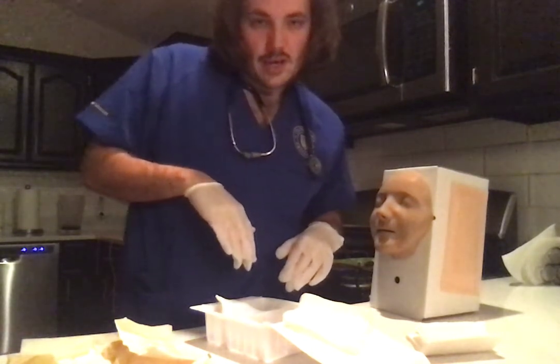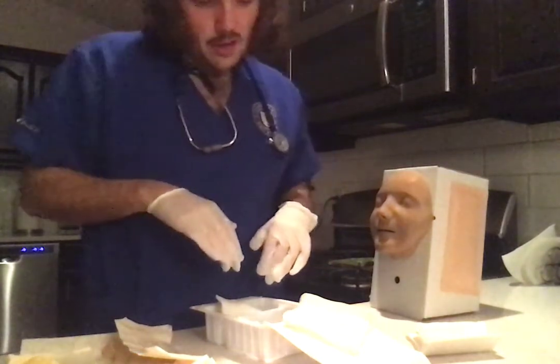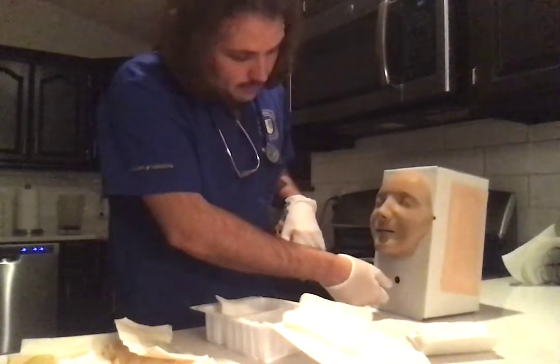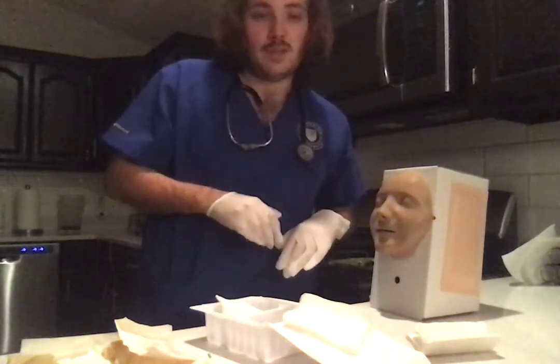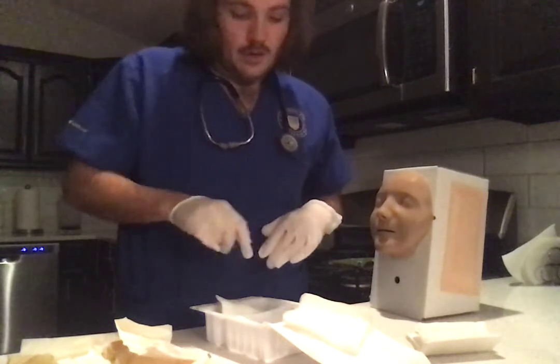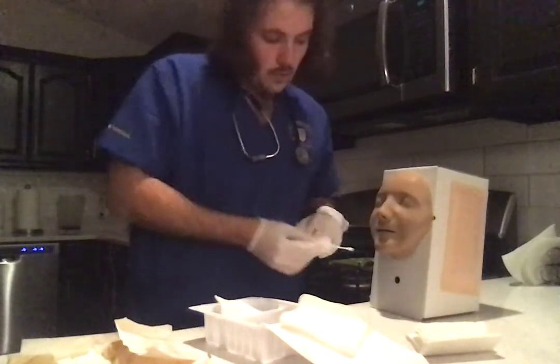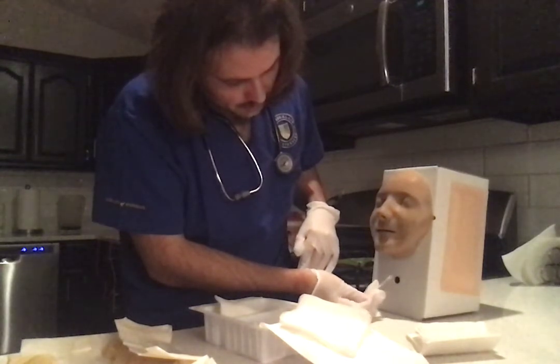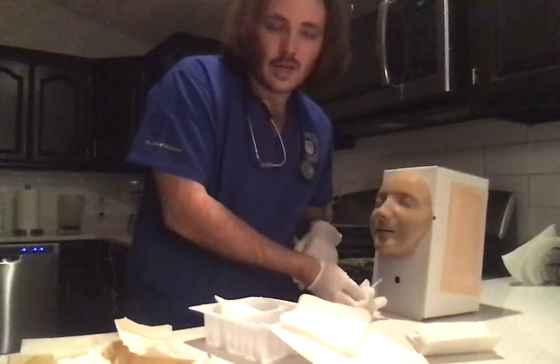At this point we would then want to insert the new cannula that we were given by Central Supply, kind of at a curve, and then you would want to turn and lock it in. It has a locking mechanism built into it. We would then continue by using our moist Q-tip cotton applicator, and we just want to make sure that all the sides are clean, starting right around the ostomy of the trach, and then move out like so.